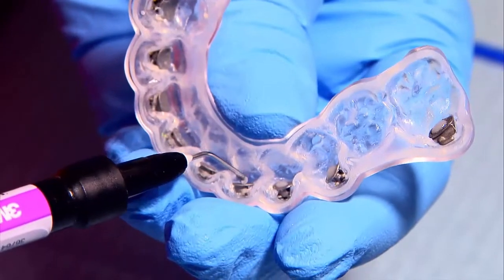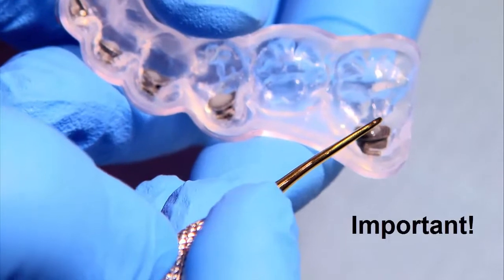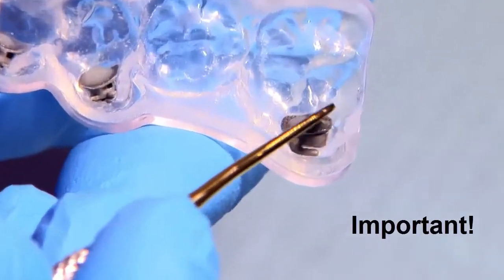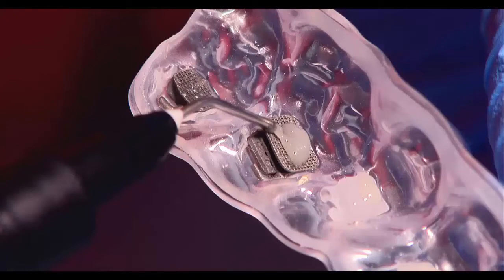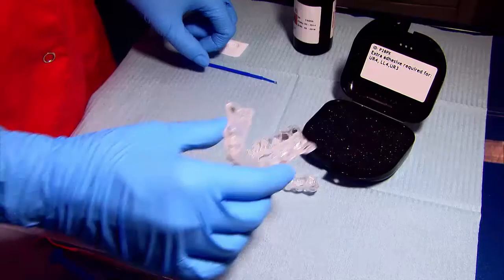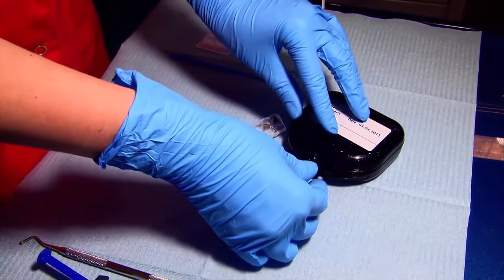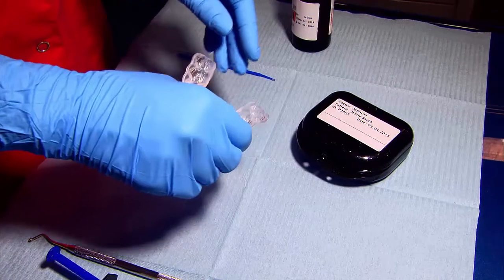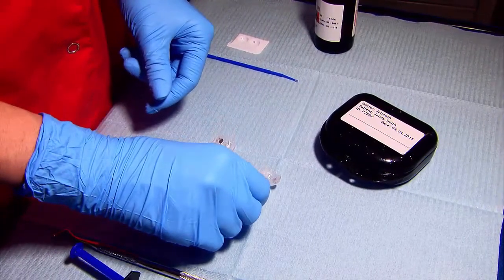Once applied, it is very important to use a filling instrument to work the composite into the mesh. It is advisable to use more composite on the molar tubes due to the size of the pads. When done, place the tray in a black light-resistant container to prevent premature activation. Then repeat the process for the second tray.